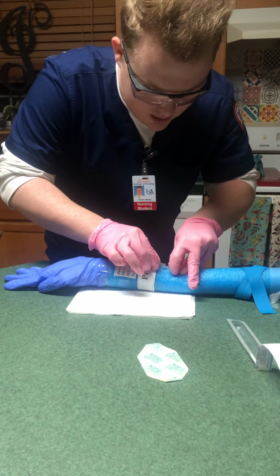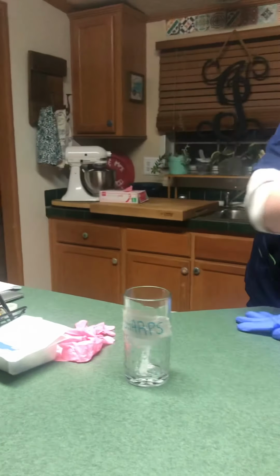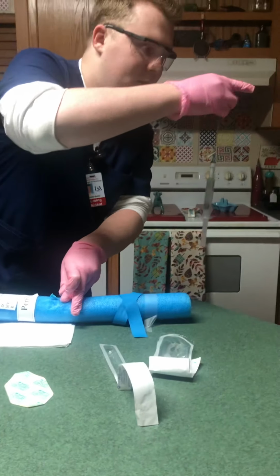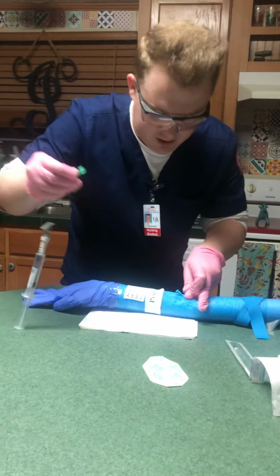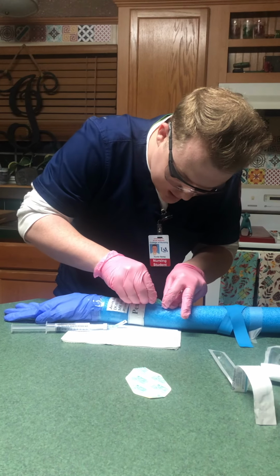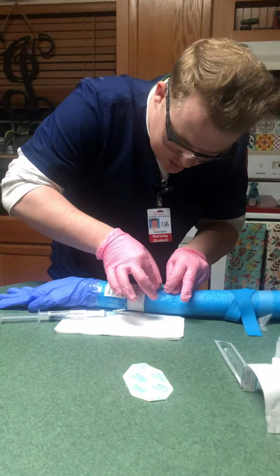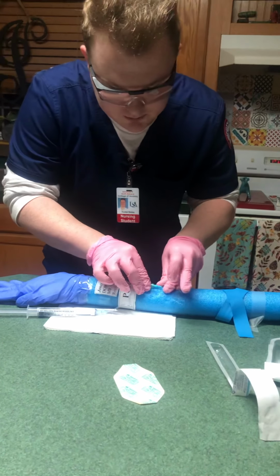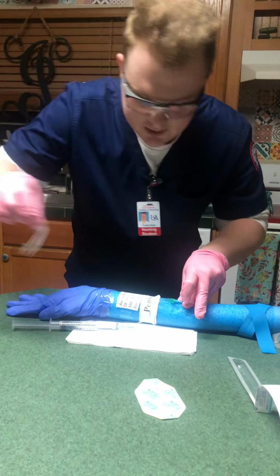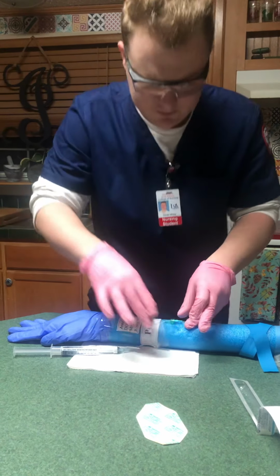I'm going to hold the catheter. Okay, so now quickly I'm going to get my J-loop. I'm going to pop the top, and I'm not touching the top of this with my finger because I'm maintaining sterility. And I'm going to lock these in place, just like this. And I'm still holding it in place. I'm getting my temporary tape and taping this.